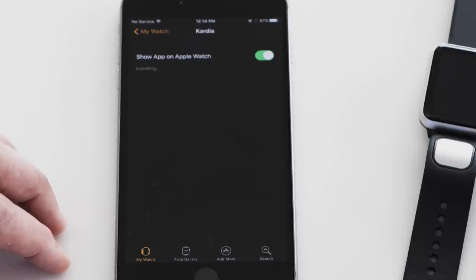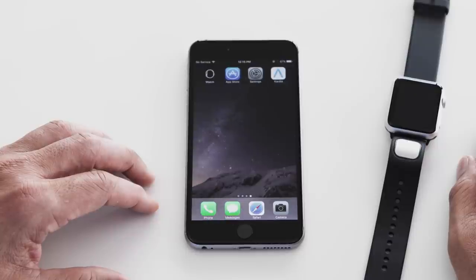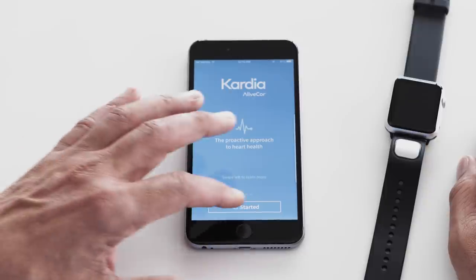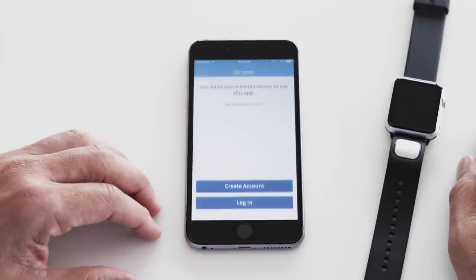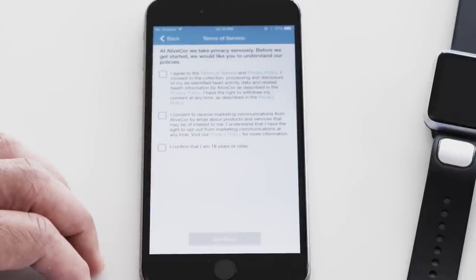It may take a minute for the Kardia app to appear on your Apple Watch. Then tap the Kardia app on your iPhone and follow the on-screen instructions and log in to your existing account. If this is your first time using Kardia, you can create an account now.